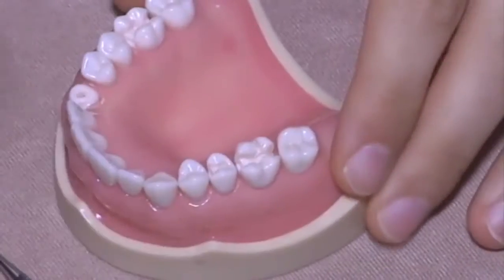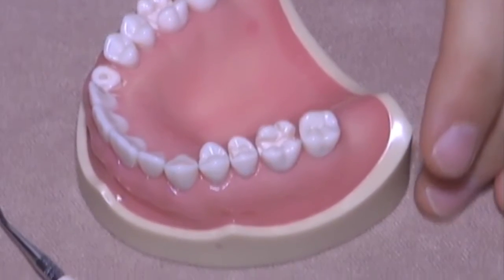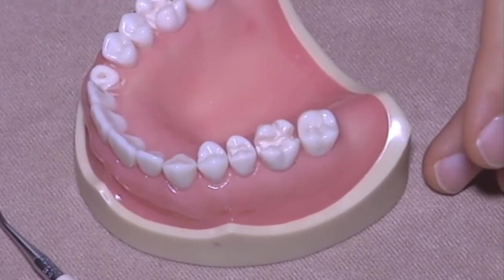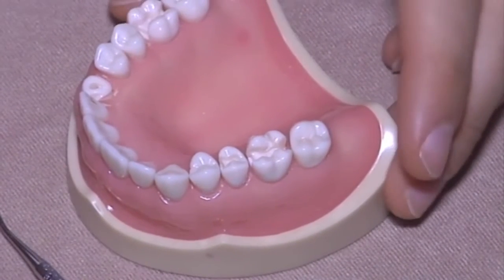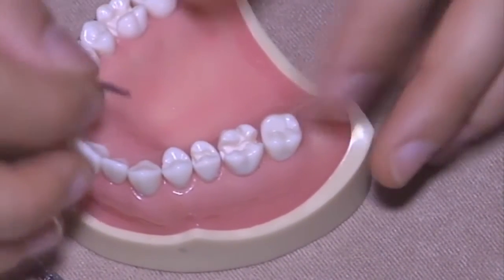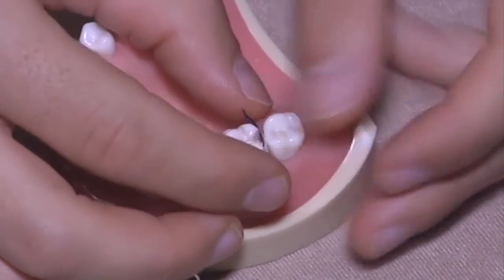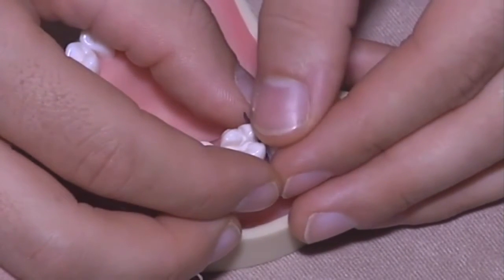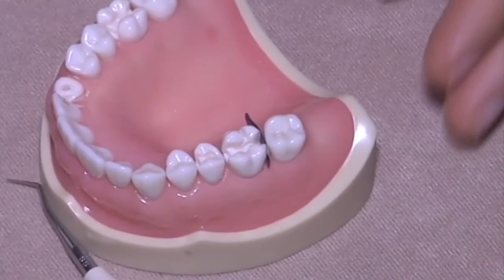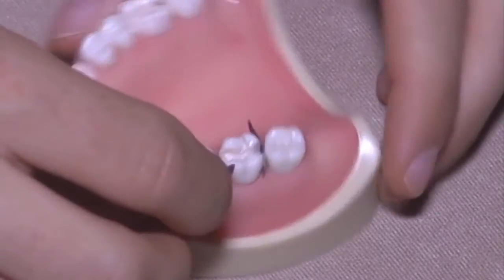Okay. So, first of all, we have to place the interproximal matrix in order to obtain tight contact points, but in order to work as efficiently as you can, I used to apply all the matrices immediately.